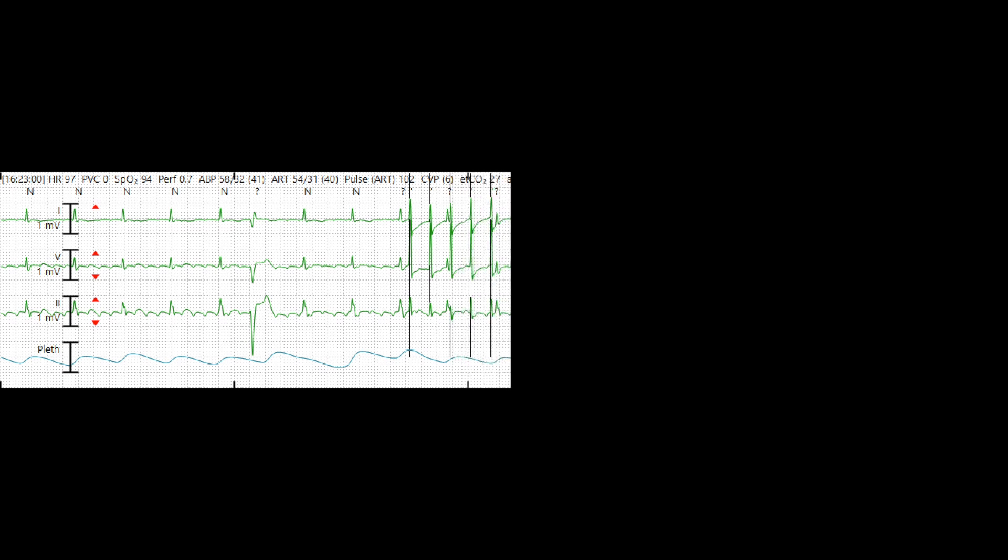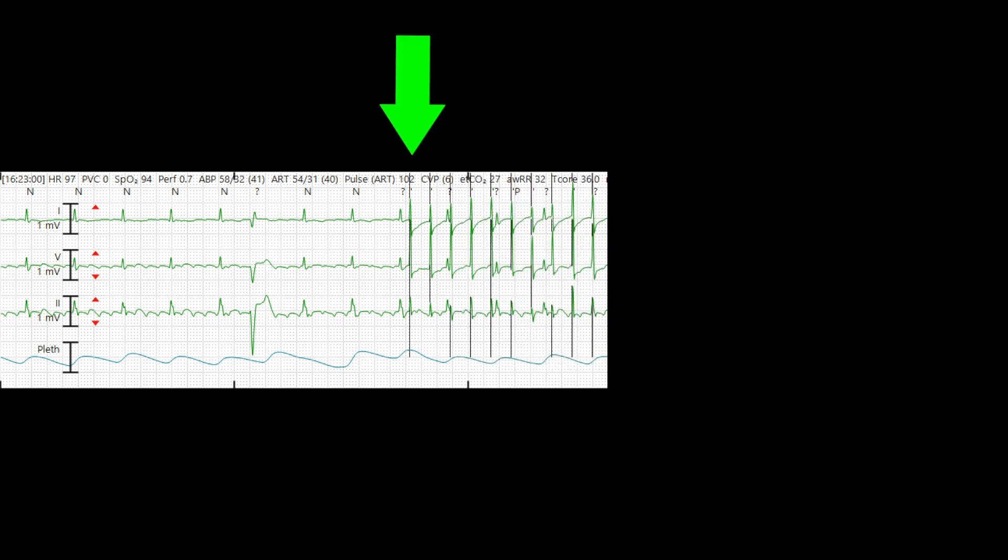This patient has atrial flutter with an atrial rate of about 300. This patient also has heart block with a junctional escape rhythm around 100. Here they are being atrially paced at a rate slightly less than 300, as seen by the black pacer spikes.